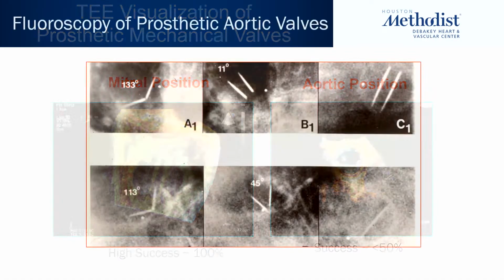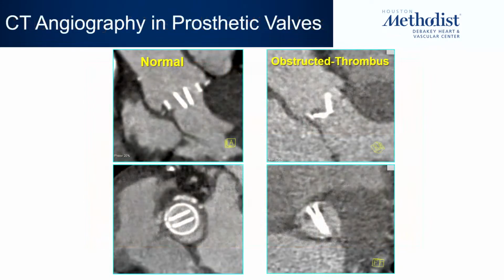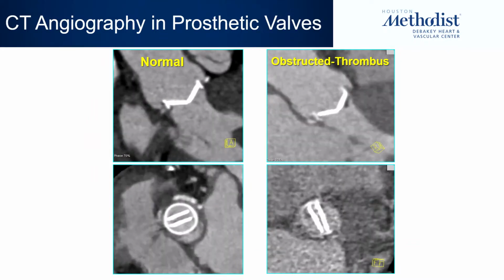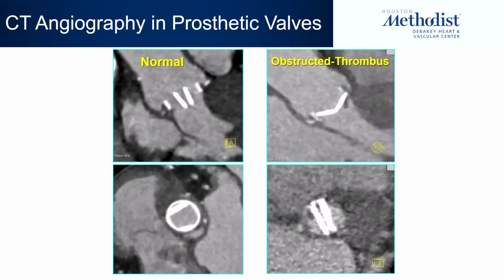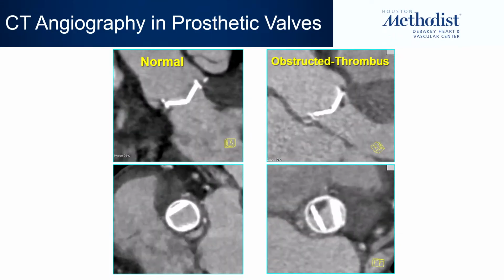So yes, you could use fluoroscopy, no dye, obviously, and there's an art to that, to tell you the truth, because I've seen some fluoroscopies that may not be that revealing. And more often nowadays, with CTA available, you could use CT without the angiography if you're concerned about motion of the valve only, and you're concerned about somebody with nephrotoxicity, if you will.